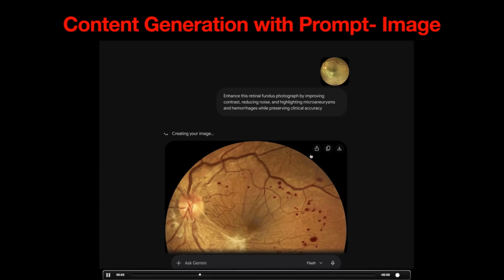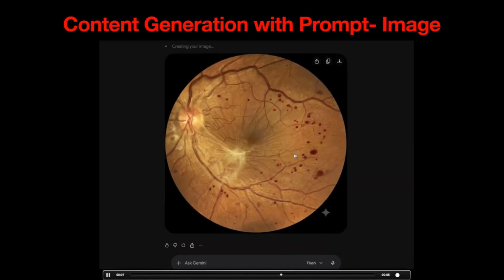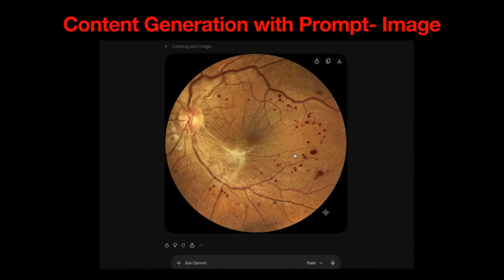So the pre-edited image is on the right-hand side, top. It's smaller, but you can definitely understand how it is. In the post-edited image, the aneurysms are well seen, because you have removed noise, or it's more of polishing the image. Keeping this in mind, let's see some more scenarios, right?